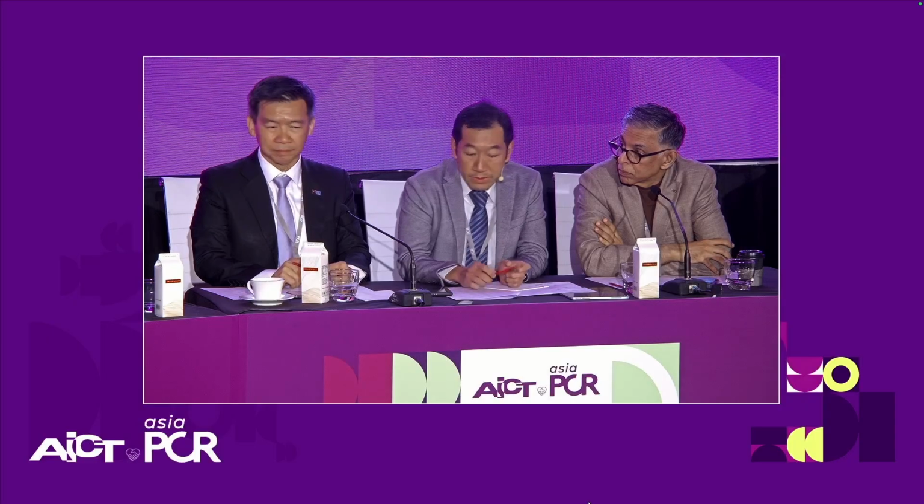I think it's about using cutting balloon after rotational atherectomy. Is that right? Yes. Because you don't have IVL. Yes, I use it a lot because I'm very aggressive with my rotaburr in heavily calcified situations. Normally, my default is a 1.75 burr, and sometimes I use 2.0.